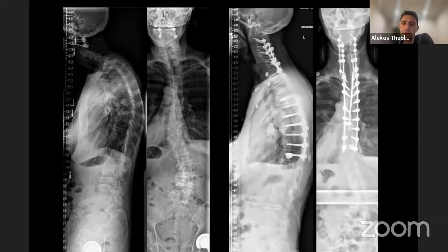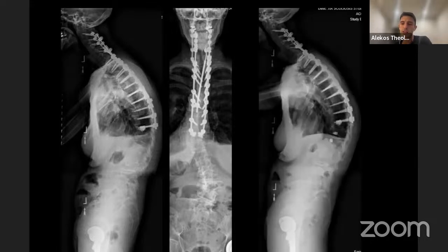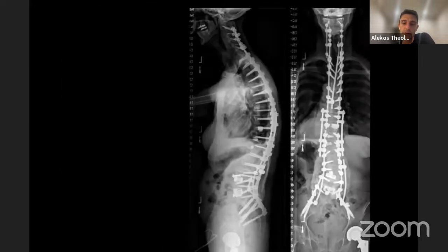It's hyperextension through the upper axial spine, OC to C1. And we ended up doing the C2 down to T10 and left the thoracolumbar deformity. But what you'll see happen is that on her first post-op x-ray, she actually fractured at the level below, so T11, which made her sagittal alignment worse. We tried to treat this non-operatively, sent her for some kyphoplasties at the level and level below. It helped her pain, but she had progressive decompensation of her sagittal plane. So we then extended her down to the pelvis after doing an L4 to S1 ALIF.